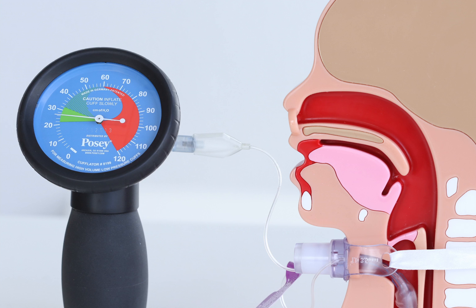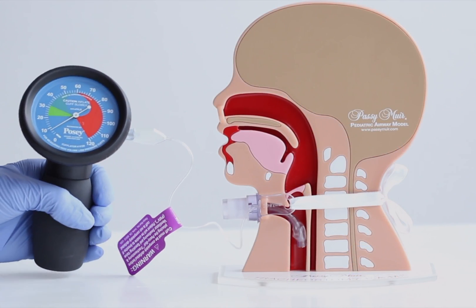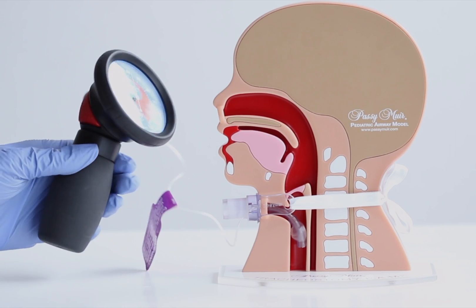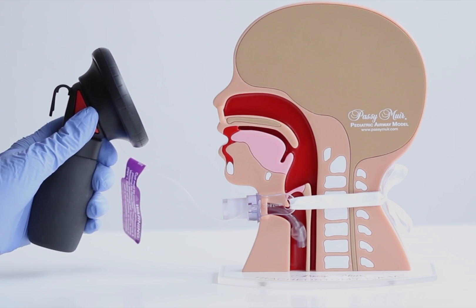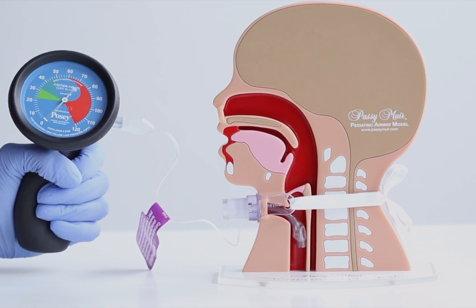The gauge shows the pressure in centimeters of water. There is also an inflator bulb and air vent button that can be used to adjust the pressure by adding or releasing air. The inflator bulb can be used to add air to the cuff if the pressure is too low. The red air vent button located on the back of the manometer can be depressed to release air if the pressure is too high.